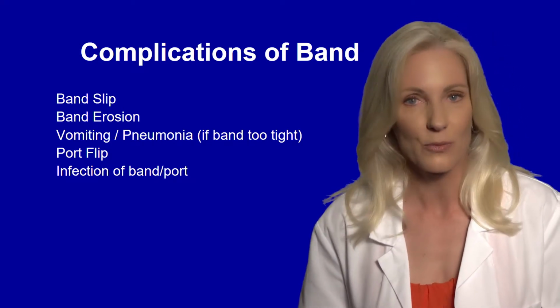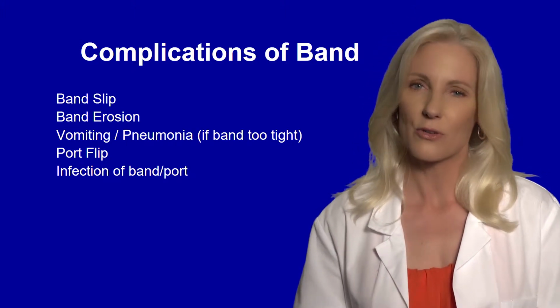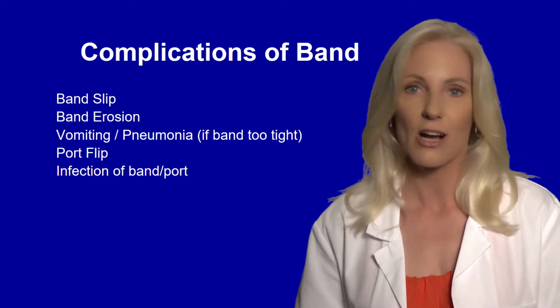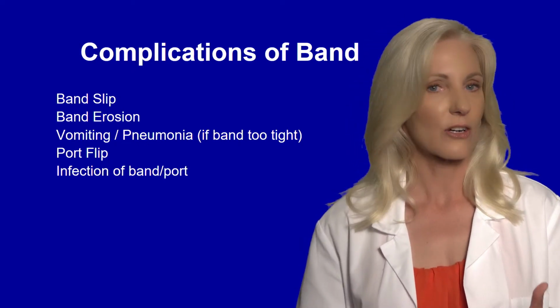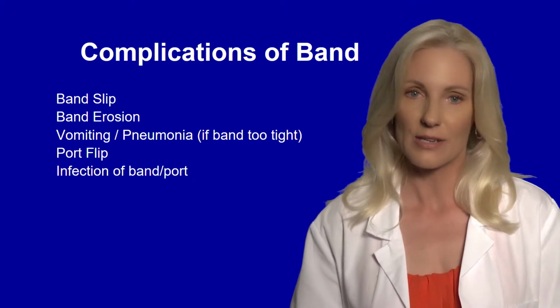That has never happened to one of my patients, but the point is you have to be careful about who you choose to put in your band and manage your band. Don't expect your primary care doctor to do it. You need to follow up with your bariatric surgeon. If your band is made too tight, you might start to vomit or even get a pneumonia, and you'll need to have your band loosened up.